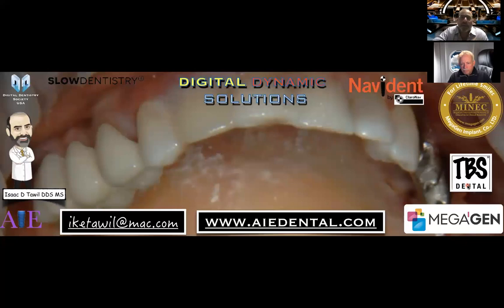So there's not going to be enough vital bone left for us to place an implant properly. If you do place the implant, it's kind of like rolling the dice, because we have to hope that area is somehow going to get revascularized.